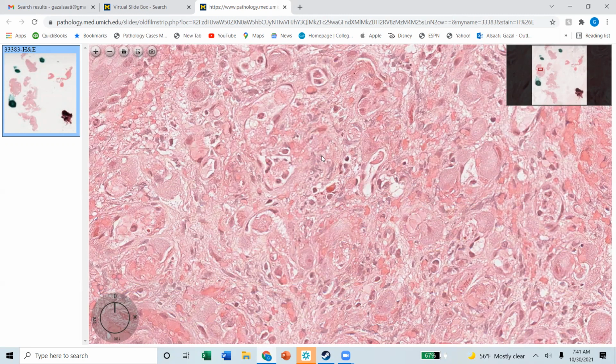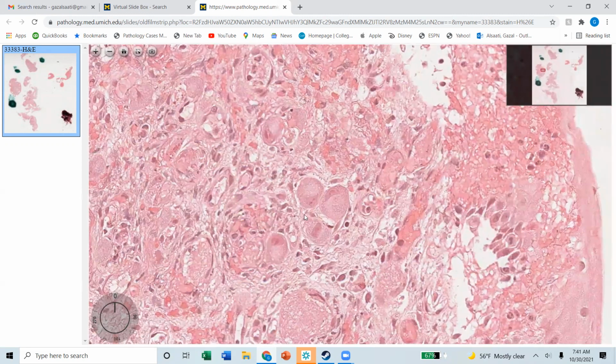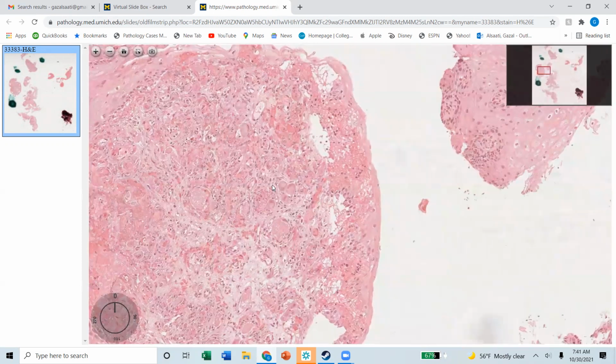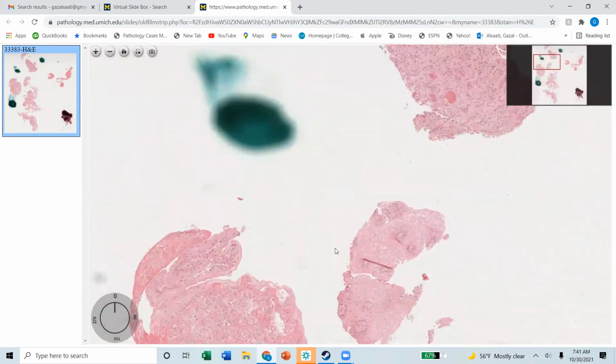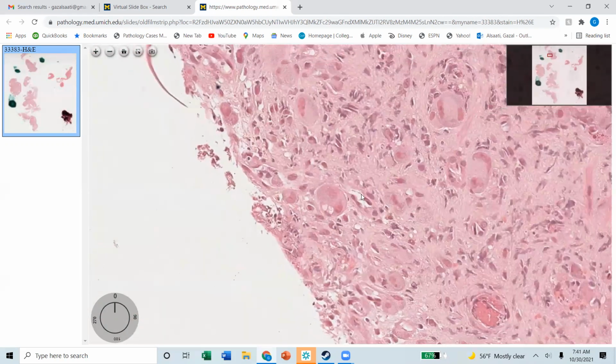How many of you go back and look for it on H&E? Oh yeah, my gosh, look at that. 1, yeah, 2, nice. 3, 4, 5. Oh, this is a nice one. Oh my gosh, if I got that, I would use it as a control for our CMV. Now more, see that?